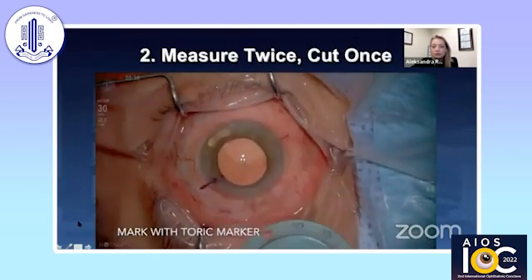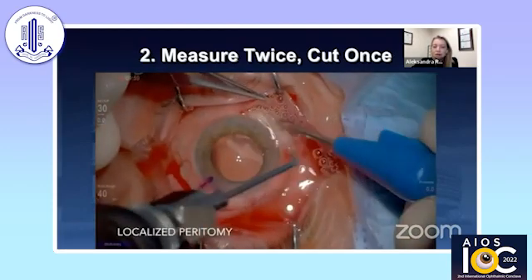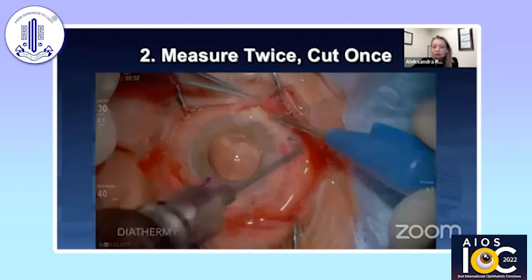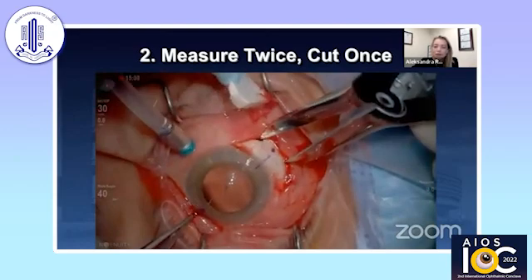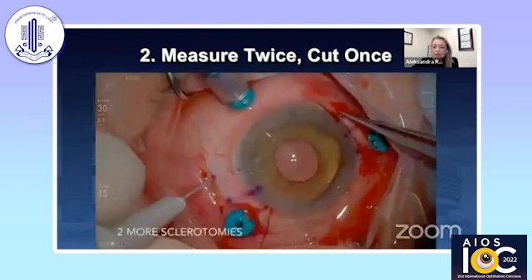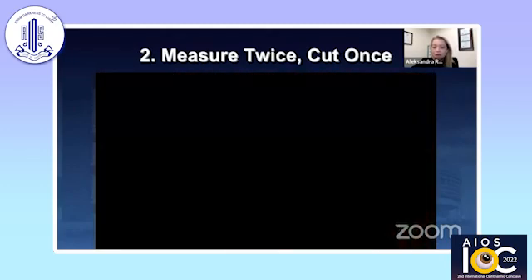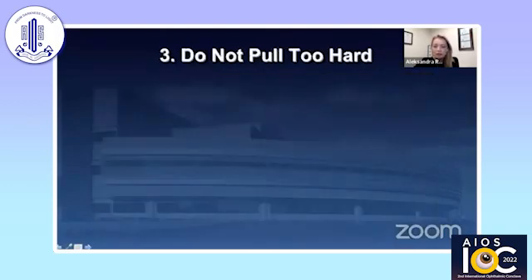It's very important to measure twice and cut once when it comes to these surgeries. I usually mark before I create my peritomies, before I put any trocars in, so I know that I'm centered. There's a lot of discussion about how far back and how far apart to go — I've modified my approach over the years, started going a little further back, and I go five millimeters in between, which allows for a nice location of the lens.